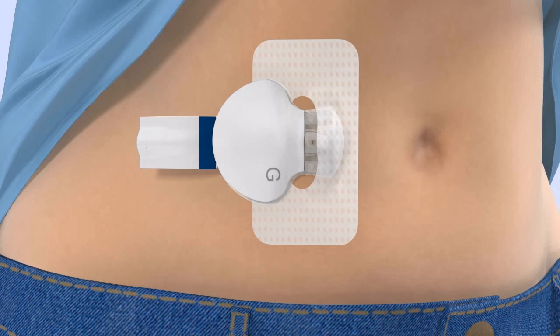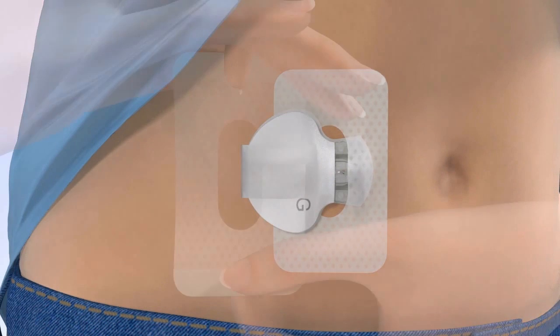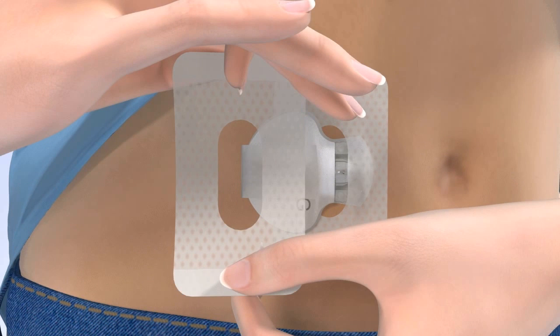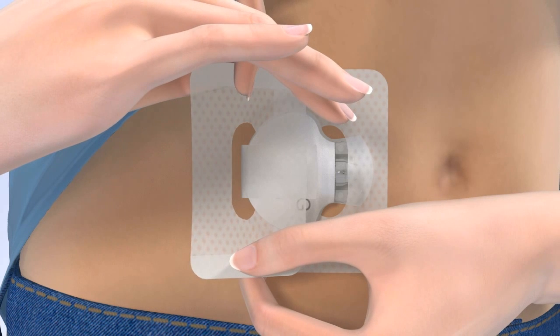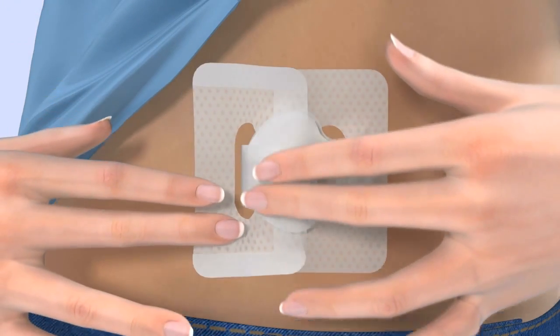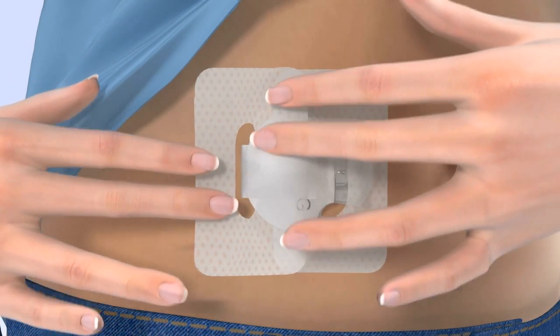Once the transmitter is connected, remove the adhesive liner from the adhesive tab, fold the adhesive tab over and stick it on the transmitter. Be careful not to pull the adhesive tab too tightly. Now apply a second piece of overtape to the sensor and transmitter. Remove the paper backing marked by the number 1. Hold the overtape by the covered ends and position it oriented the same way as the first piece of tape. Apply one side of the overtape so that it covers the center of the transmitter and apply the other side directly on your skin. The hole in the center of the tape should expose the back of the transmitter. Smooth down the tape on your skin and transmitter. Finally, remove the paper backing marked number 2 and press the remaining overtape against your skin.